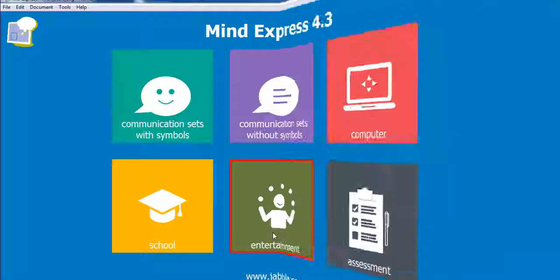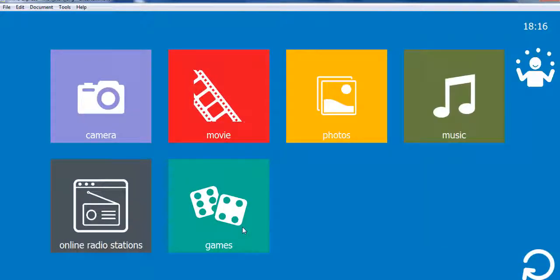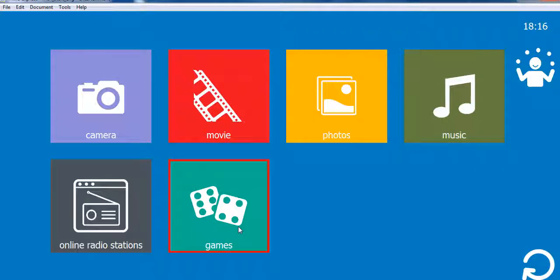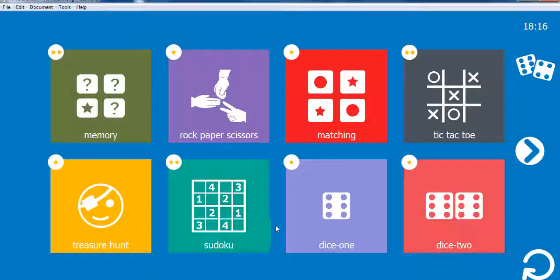In the entertainment section, you'll be able to watch movies, listen to music or radio programs, take pictures or play games.